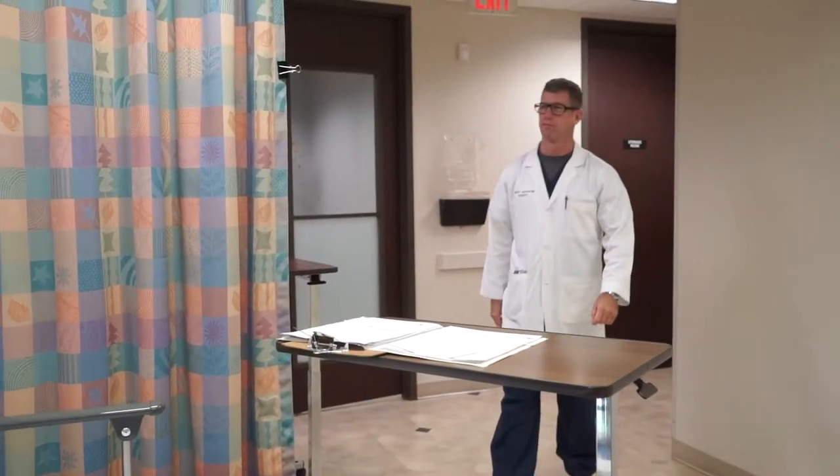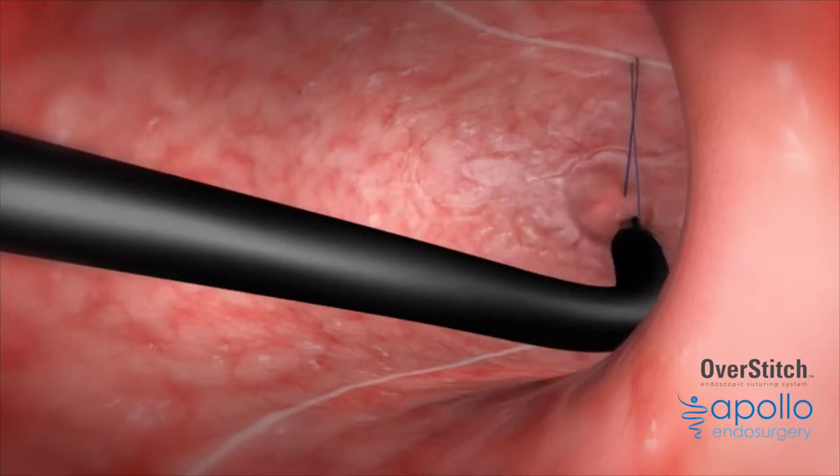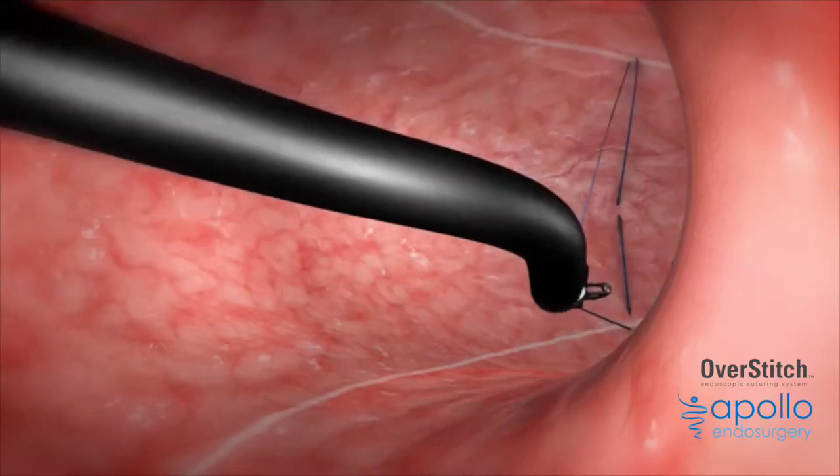We've got a new procedure called the endoscopic sleeve gastroplasty. We're very excited about that. It doesn't really involve surgery — there are no incisions in the abdomen and the patients recover a lot more quickly. We're able to do this because of a revolutionary suturing device that fits on the end of a normal endoscope that we use routinely for other procedures.